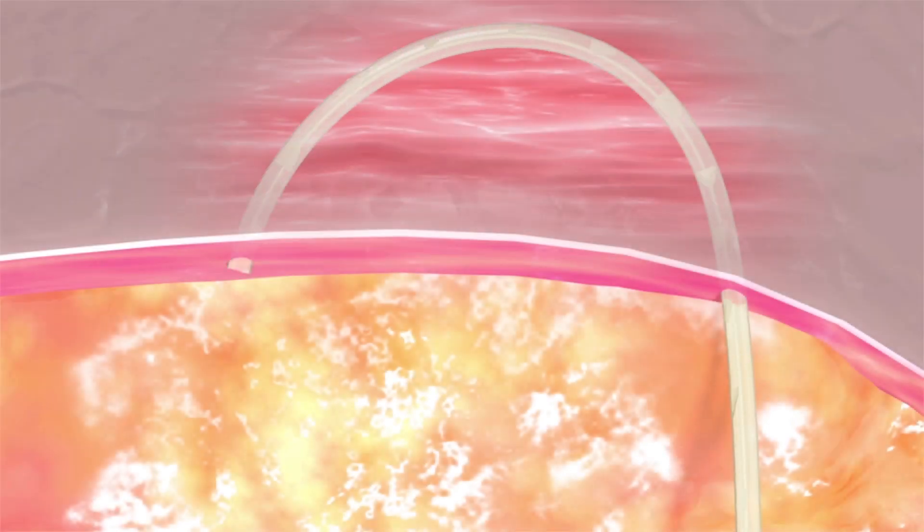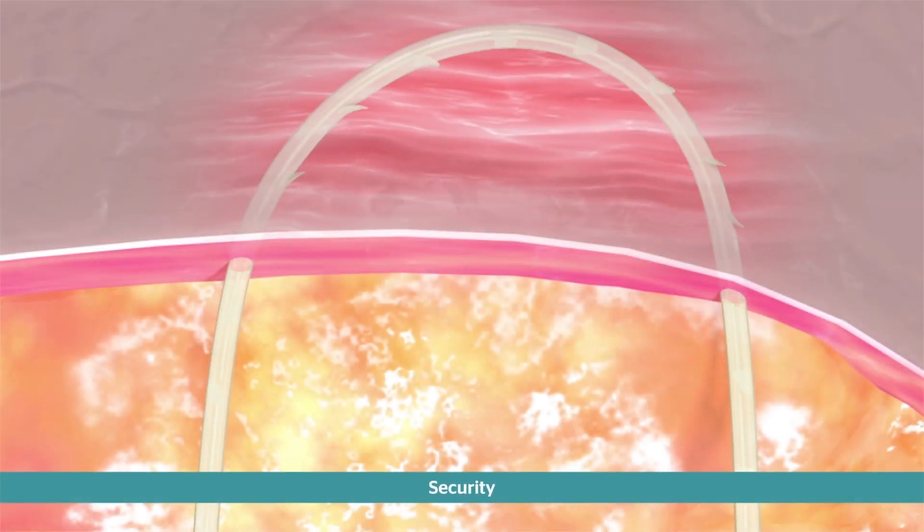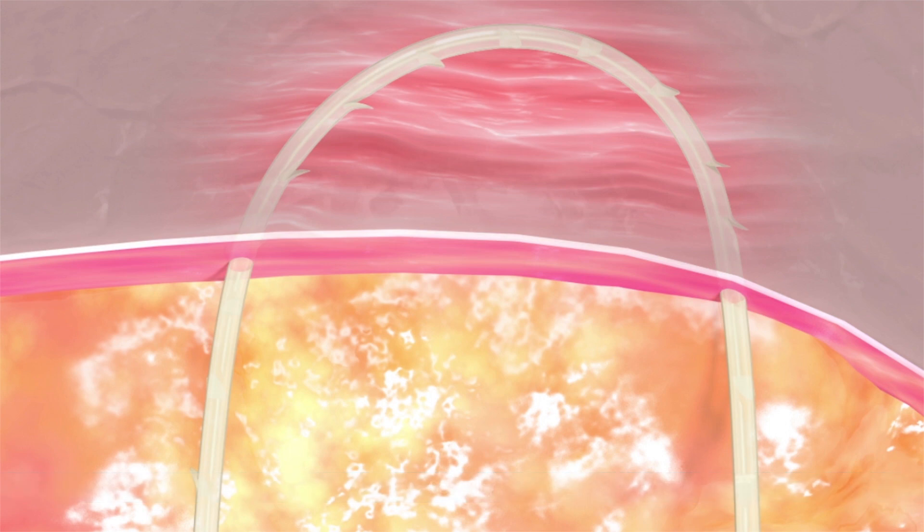Bidirectional Stratafix features barbs cut into the core of the suture in a spiral pattern. The barbs retract into the core and then re-engage for a secure three-dimensional hold, offering smooth tissue pull through similar to traditional monofilament sutures but with greater tissue holding strength.